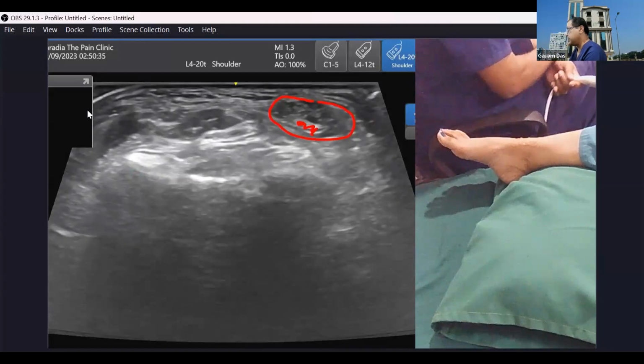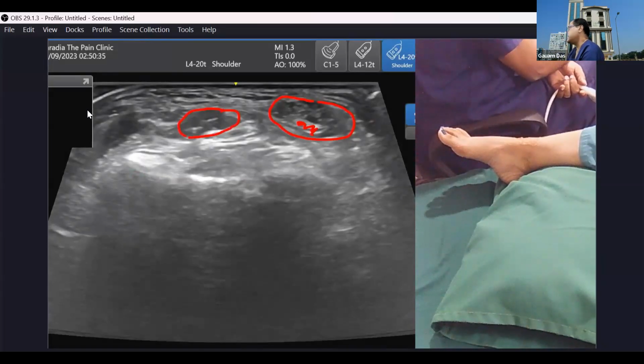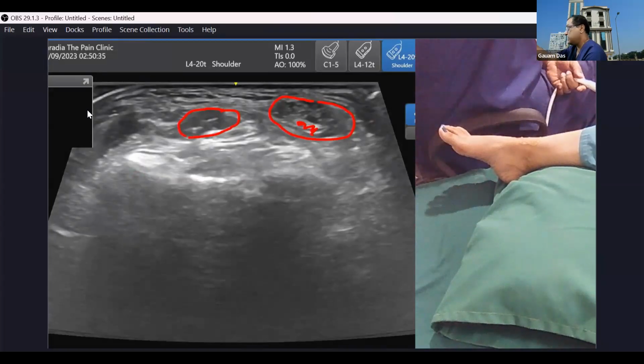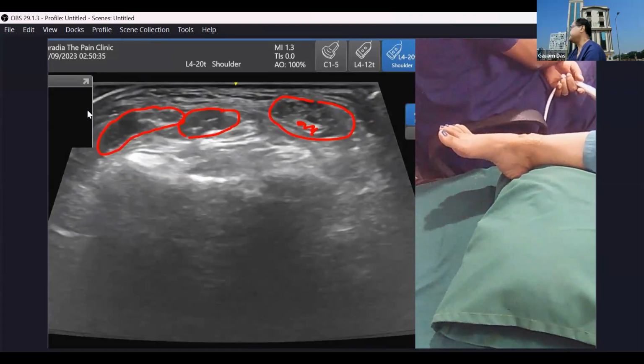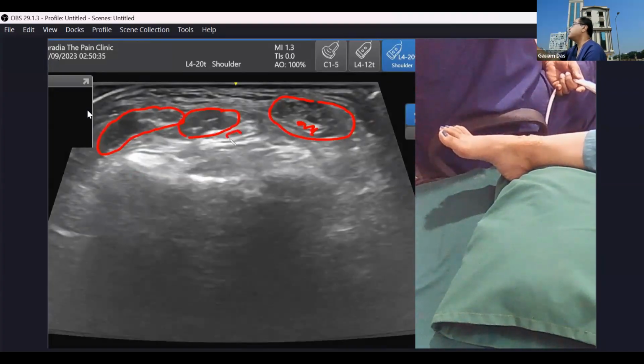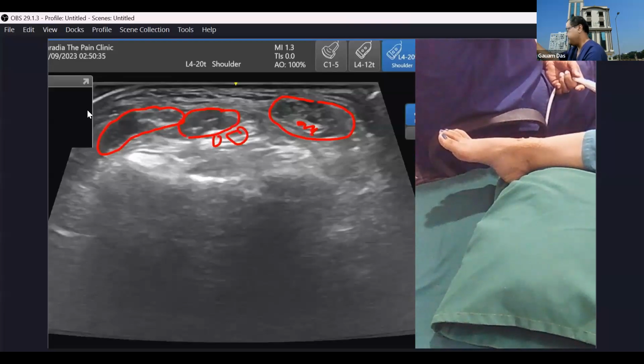So this is your tibialis anterior. And then we are having the extensor hallucis. Here the mnemonic was opposite, Tom, Harry, Dick. And this was the common sheath for the peroneus tertius and the extensor digitorum. And here were your blood vessels, here was your nerve. So let me put it again.